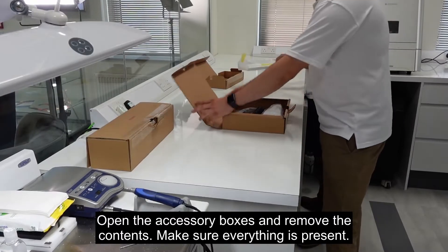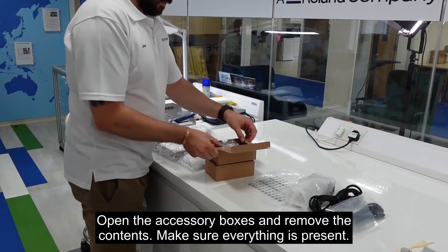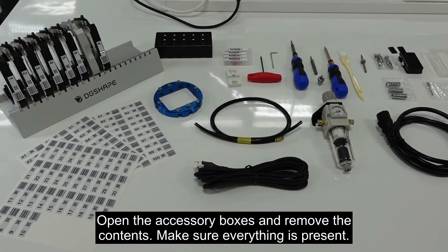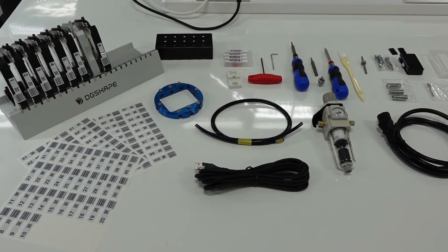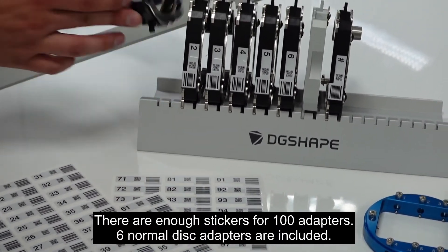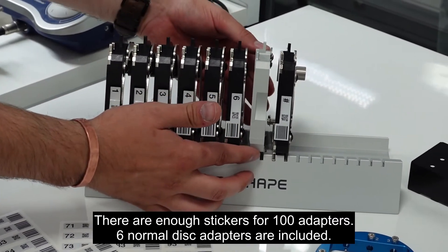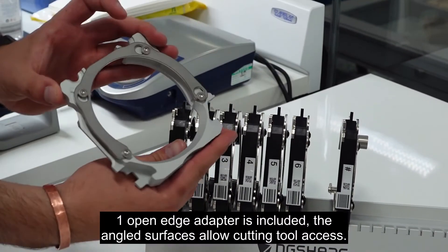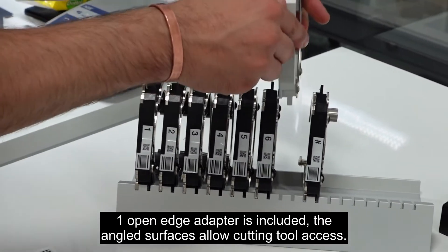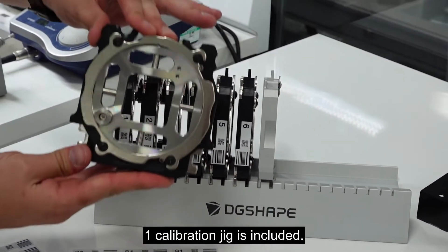Open the accessory boxes and remove the contents. Make sure everything is present. There are enough stickers for 100 adapters. Six normal disc adapters are included. One open edge adapter is included — the angled surfaces allow cutting tool access. One calibration jig is included.